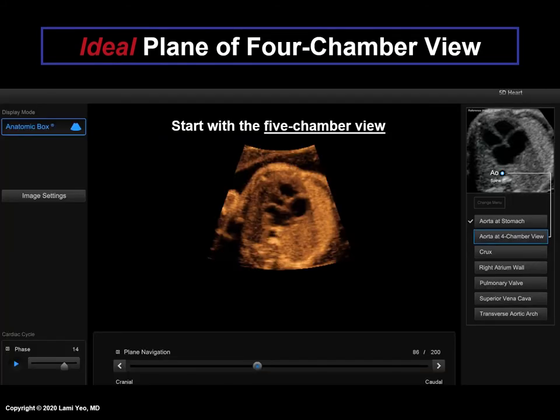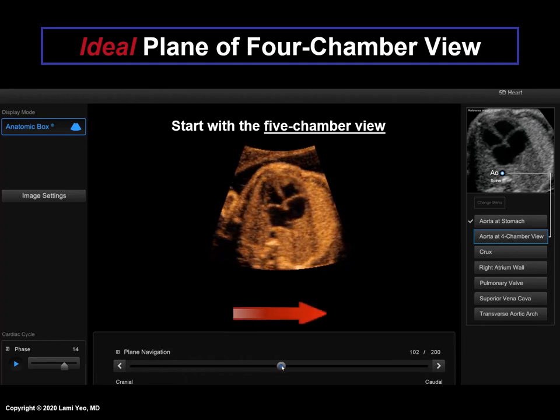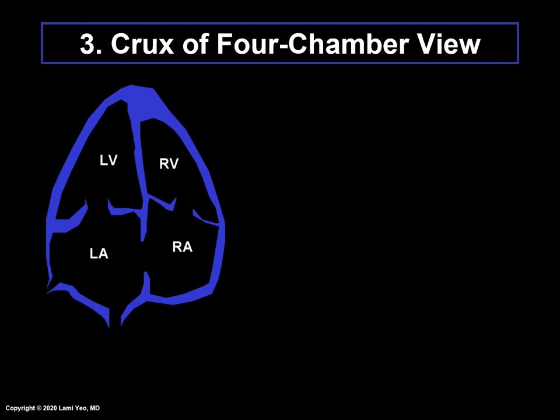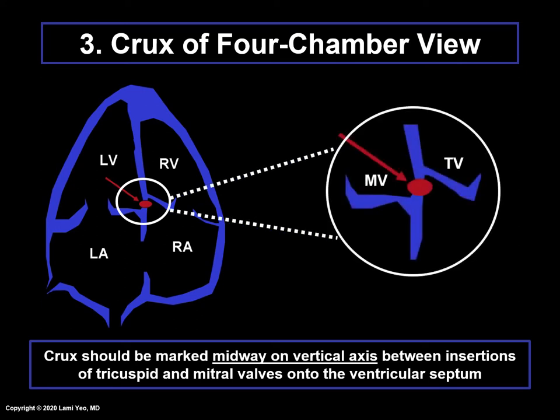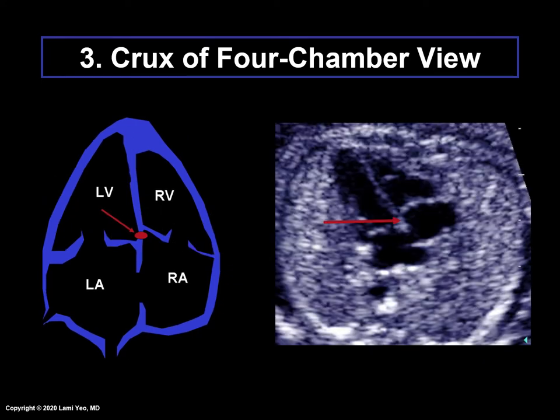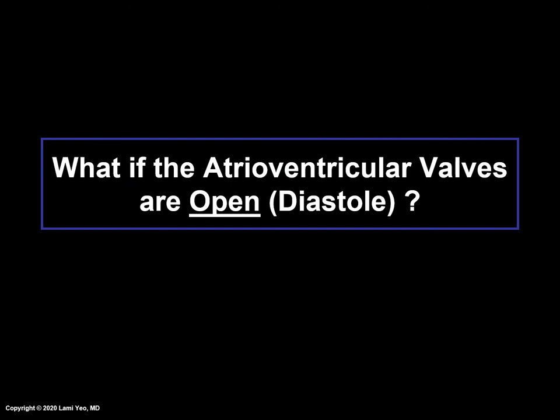Here is an example of finding the ideal plane of the four-chamber view. We always recommend starting from the five-chamber view and then scrolling caudally by moving the scroll button to the right. Normally, the atrioventricular valves are offset — the tricuspid valve annulus inserts slightly more apically on the ventricular septum than the mitral valve. The crux should be marked midway on a vertical axis between the insertions of the tricuspid and mitral valves onto the ventricular septum. FINE recognizes the cardiac phase and will automatically close the atrioventricular valves so the user can mark the crux.